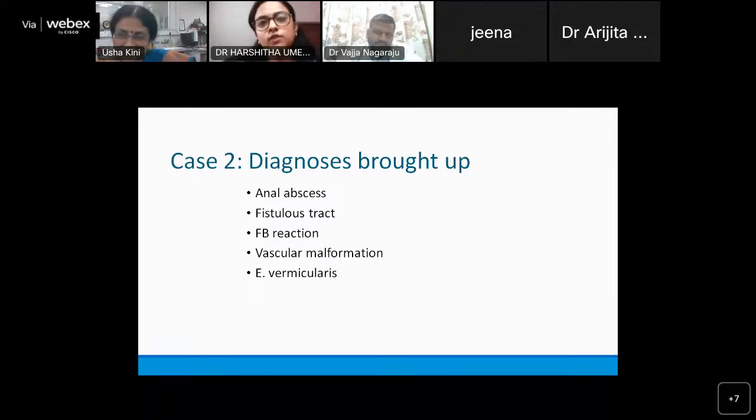That vegetable matter which was seen can be mistaken for Enterobius vermicularis, but it doesn't have the structure, right? If you Google any of those pictures, I'm sure you will get a nice Enterobius with alae on either side. You will see the muscular wall. We didn't find that. This was vegetable, whereas the worm should have little mucus in its content, right?